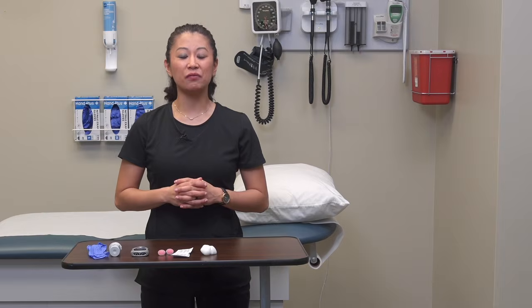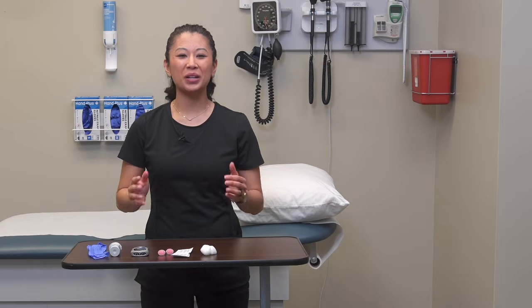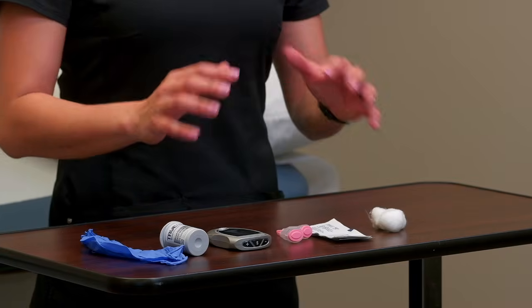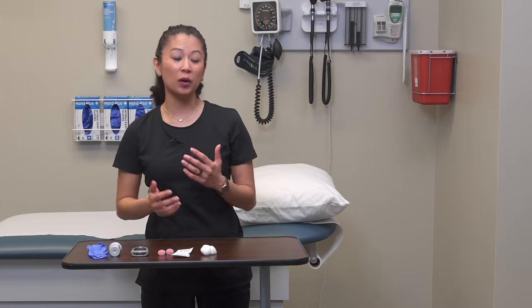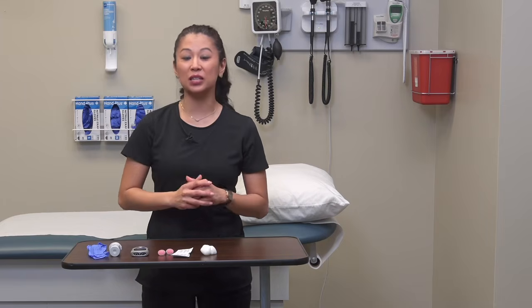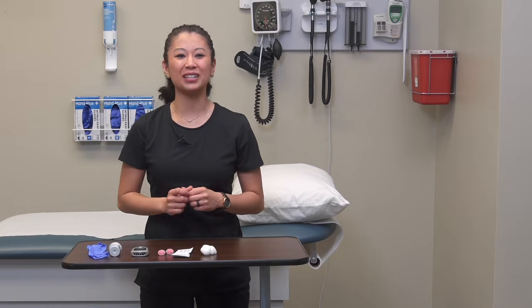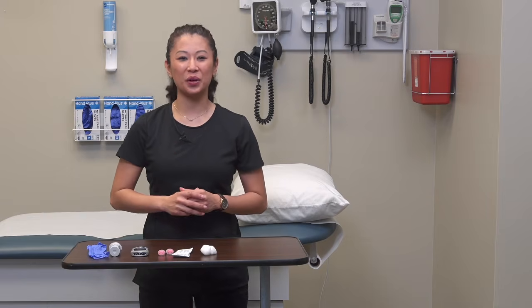Let's take a live look at how we obtain a blood glucose sample from a patient. So I'm going to go ahead and do this on myself today and just talk you through this. And I've got my supplies here ready. So the first thing, after we perform our hand hygiene and we've explained this to the patient, we want to make sure also we have the right patient by using our patient identifiers, the patient's name and date of birth.